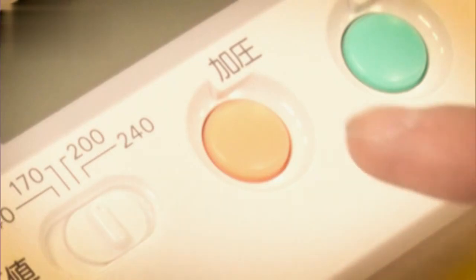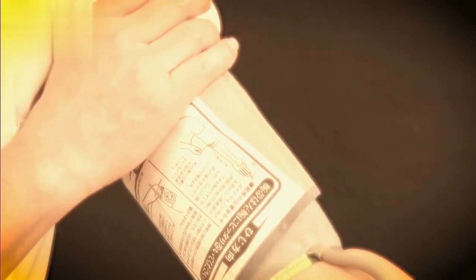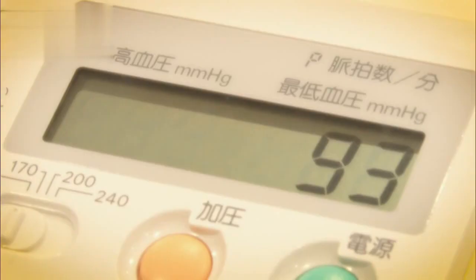After pressing the button, the built-in pump would send air to the cuff. In order to obtain a measurement, just slightly more pressure than the user's actual blood pressure needed to be applied to momentarily stop the flow of blood. The available model required the user to choose from one of 4 pressures between 140 and 240. If the wrong setting was picked, the pressure might be too strong, causing pain or discomfort. If the pressure was too weak, it wouldn't measure correctly.